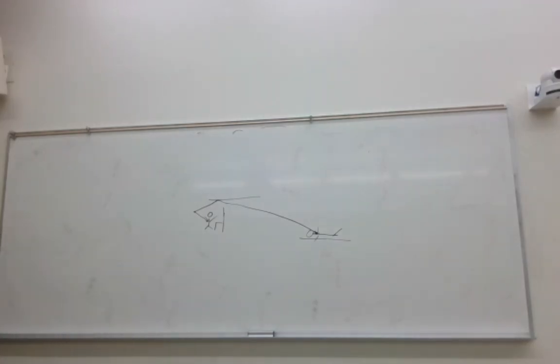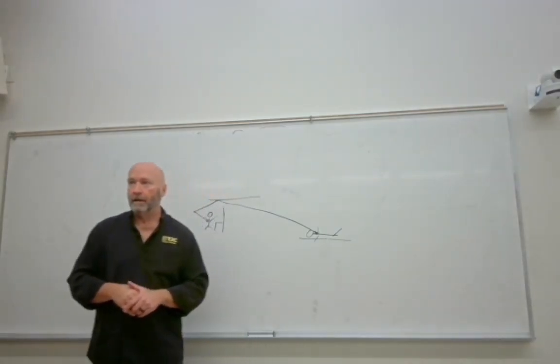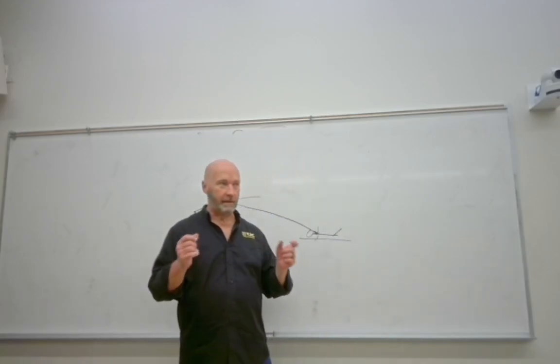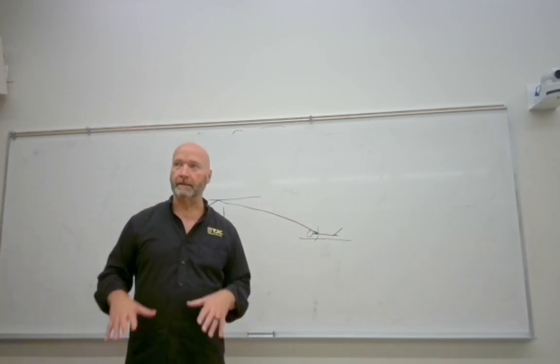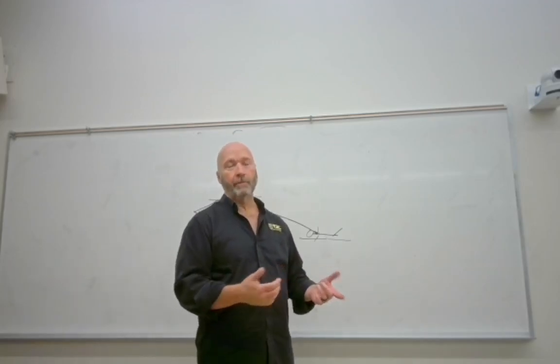Some other things that will identify your system is how the tabletop moves. All right, so with a radiography room, what you've got are those solenoids, and what we refer to as a floating tabletop. So you step on the pedal, and the tabletop will go anywhere you want it to go. And we already established that if you lean on that tabletop, it will move.